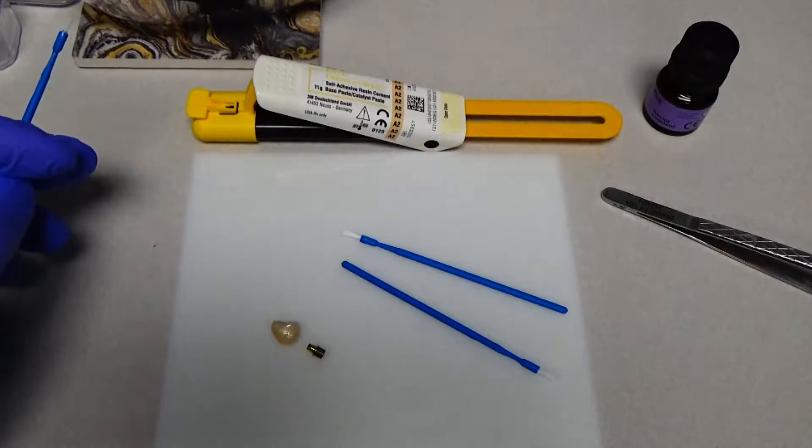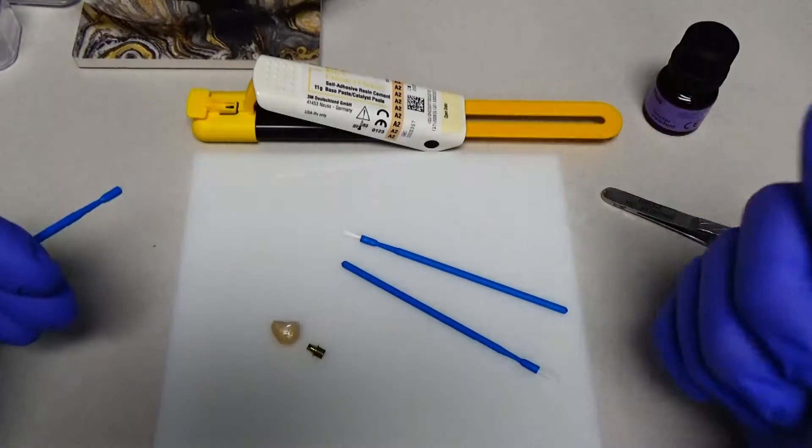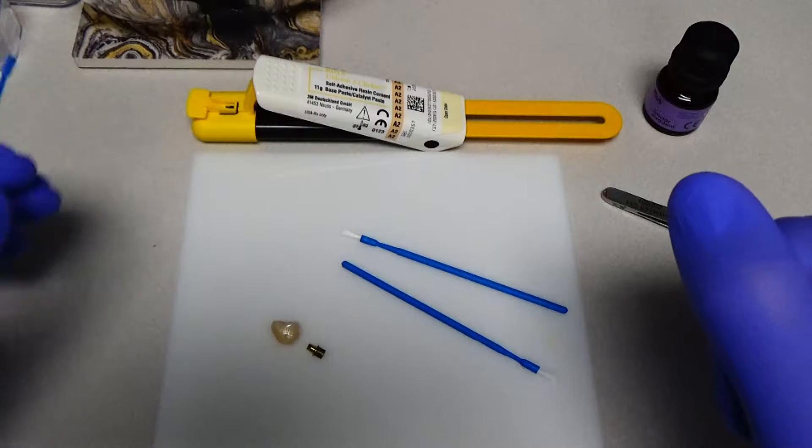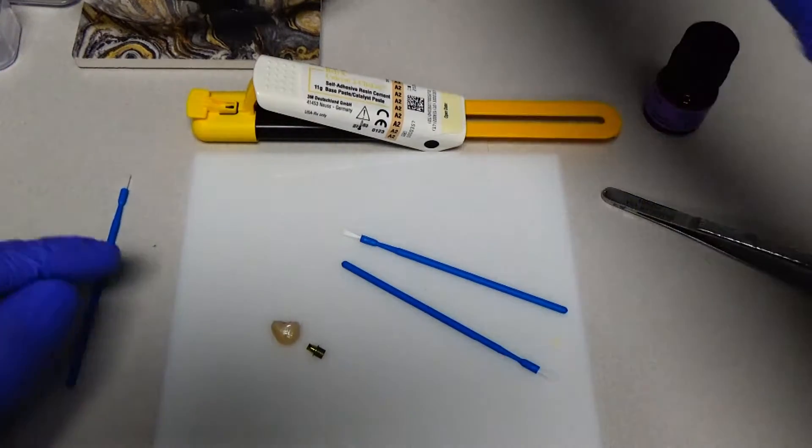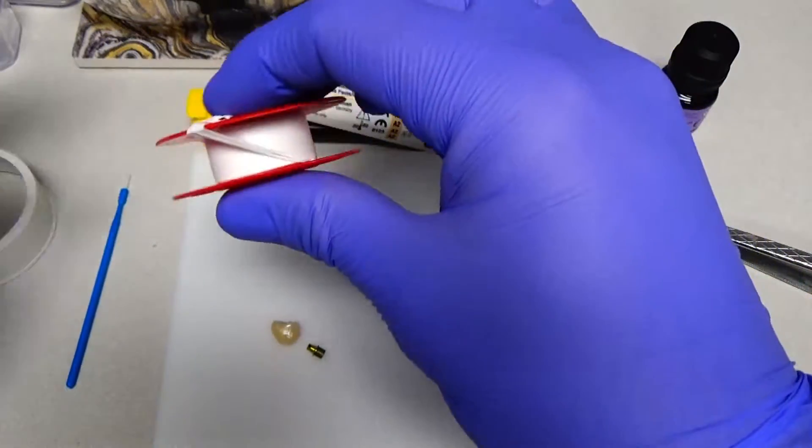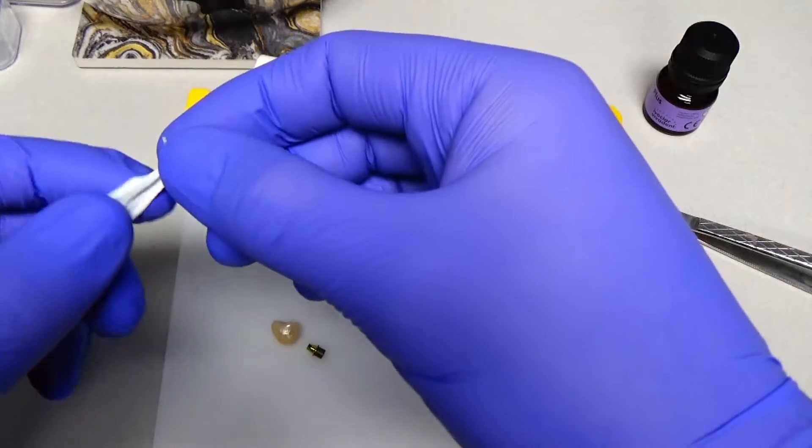The thing to keep in mind about the Monobond Plus is that at this point you don't want to be touching it with your bare hands. I like to use gloves whenever I'm dealing with this just to have as little amount of contamination as possible. And then whenever you lute everything together, you also want to use Teflon tape in order to protect the internal channel.